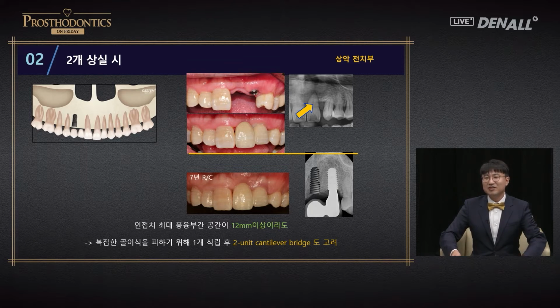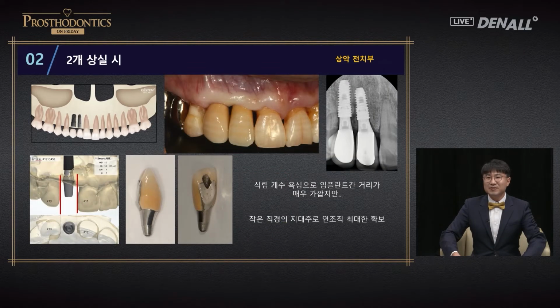Doing cantilever in the anterior without giving it much thought, I think there could be problems. There was an implant in number 13 and number 12 was lost additionally. Although it was a bit of a stretch, I placed it in the tight space. If you look at the abutment image, because of the height of contour and drill direction, I was not able to move more easily. Yes, I could have done better. If the inter-implant space is too close, I try to make the abutment as thin as possible to get more soft tissue space.